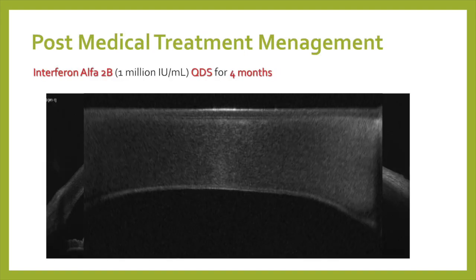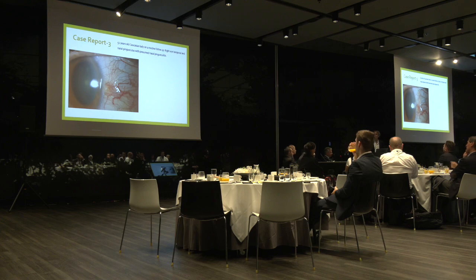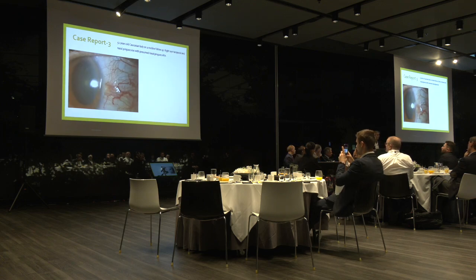I'm pleased. And this is the final case I'm bringing to you. This is what looks like just a pinguecula with inflammation. This patient had bilateral pingueculas on the nasal and temporal sectors, and came just for a regular follow-up. It looked like a regular pingueculitis, but it looked weird to me, too many vessels. I didn't like it. But of course, if you don't have the MS-39, you're not going to bring this patient to theater; you are going to follow up. But with the MS-39, you have the diagnosis in 1 minute.